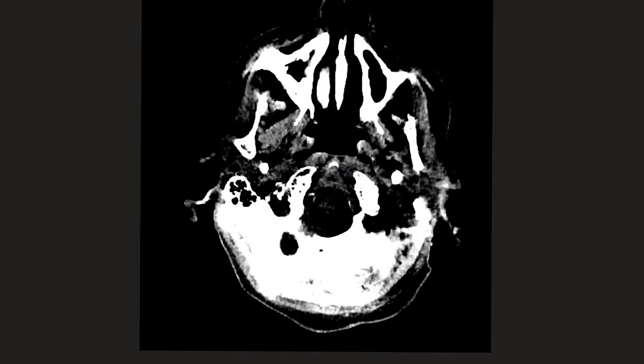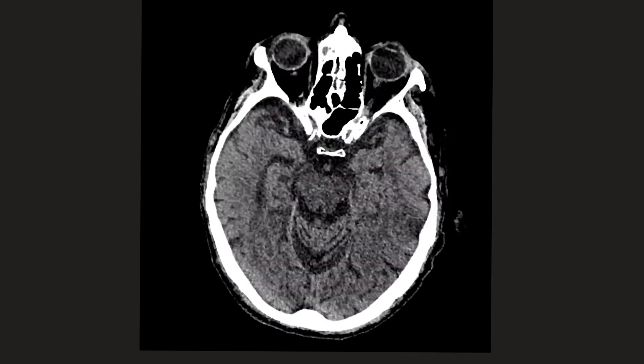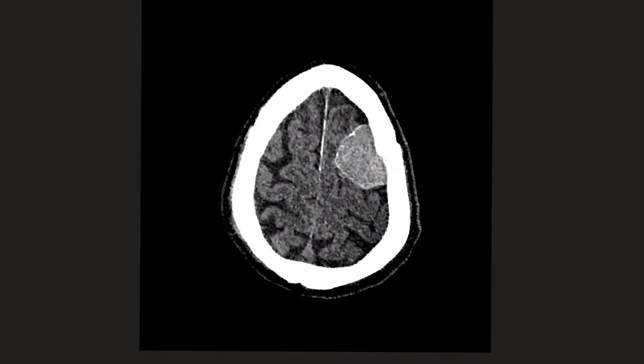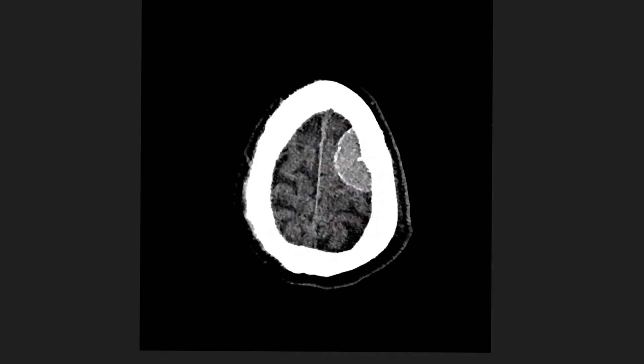Let's take a look at this first case. As we're scrolling through the brain, we can see that there's a large space-occupying lesion in the region of the left frontal lobe. The first thing to say is that it has a rather broad dural base. Secondly, you can see some CSF between the lesion and the brain. Thirdly, better seen on the other slices, you can see that there is preservation of the grey-white matter junction.